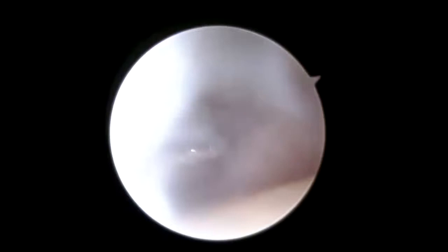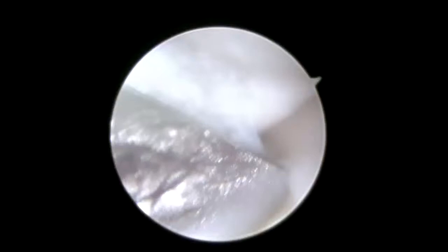There's inflammatory tissue there — the synovitis, which is inflammation of the joint lining — that red material. And you can see some other ligament tissue which is enfolded into the joint and keeps on irritating and inflaming it. We're just going to remove all of that and get back to a nice joint.